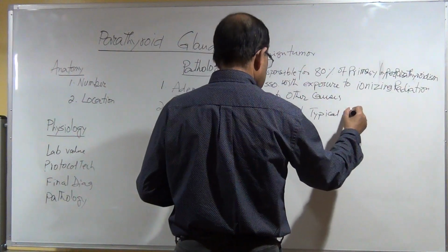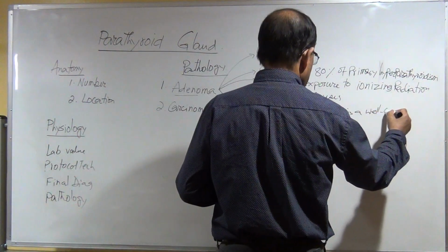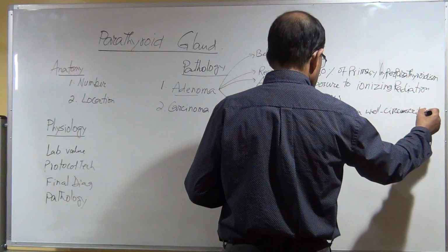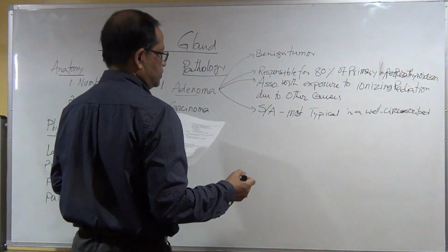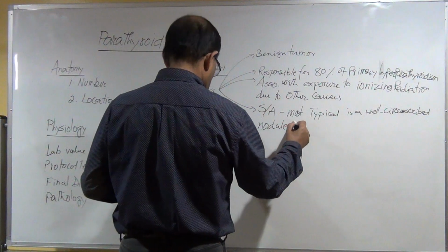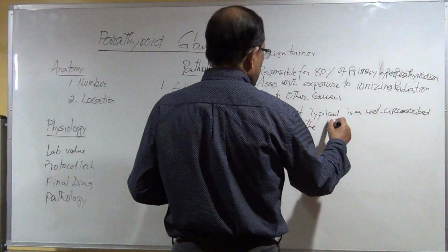Well circumscribed means it is clearly seen.